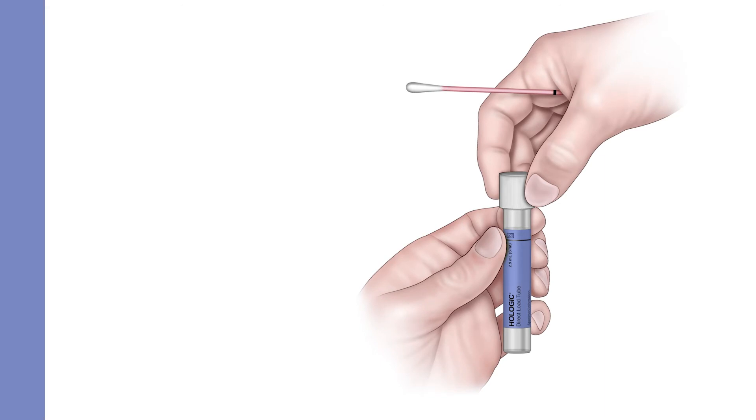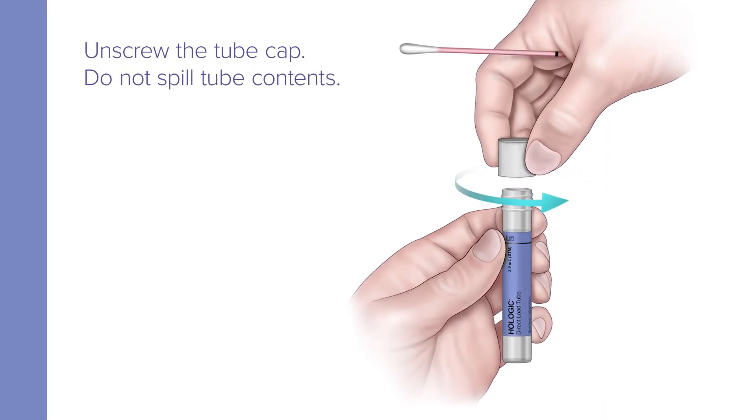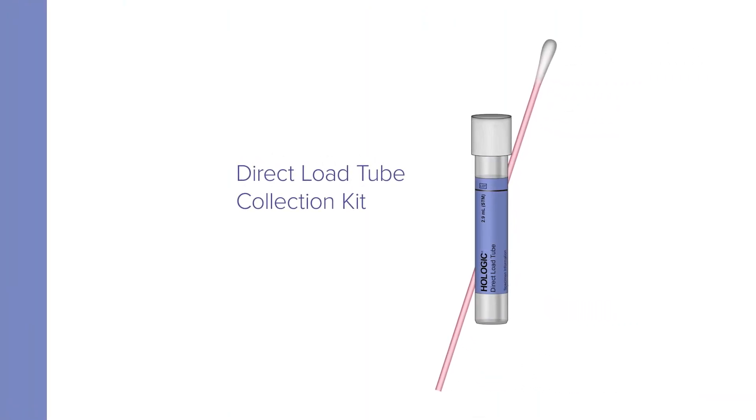Remove the swab from your nostril. While holding the swab in hand, unscrew the tube cap. Do not spill the tube's contents. If the contents are spilled, discard and replace with a new Direct Load Tube Collection Kit.